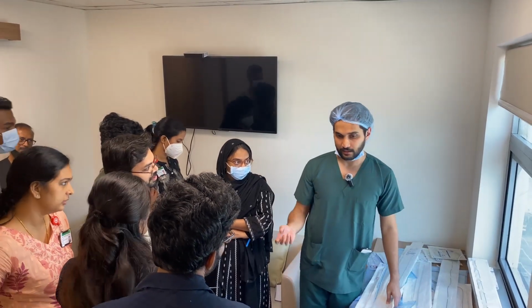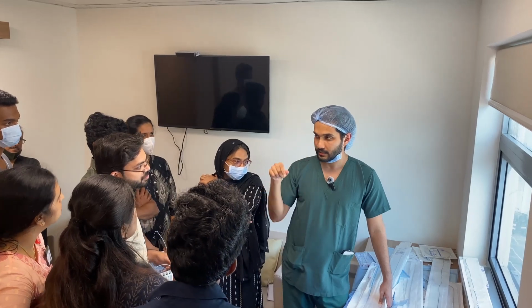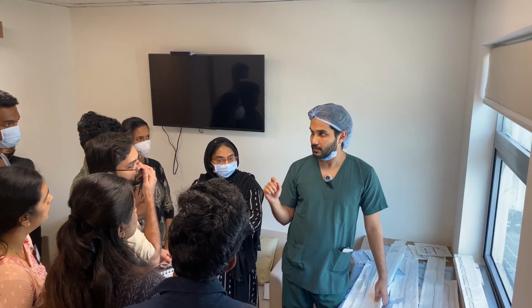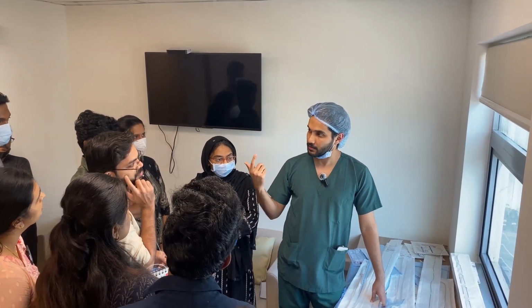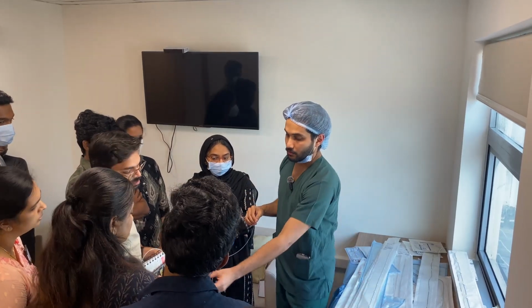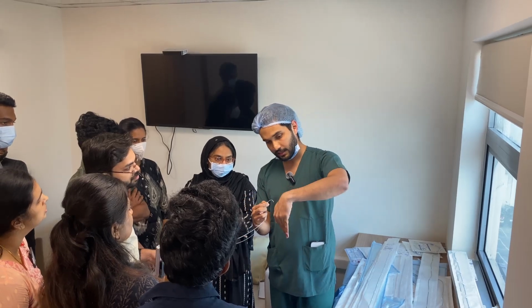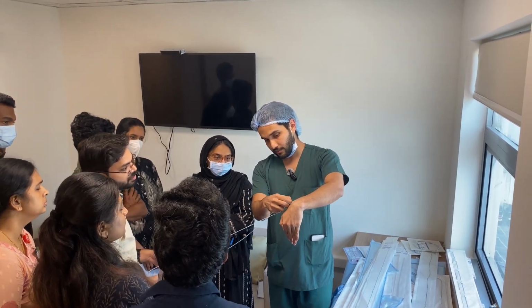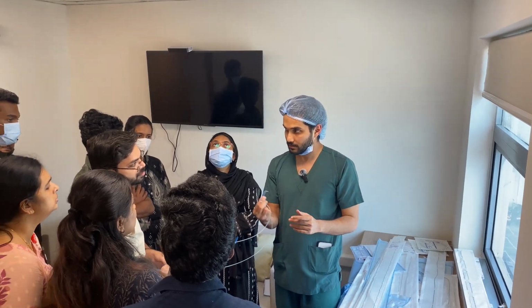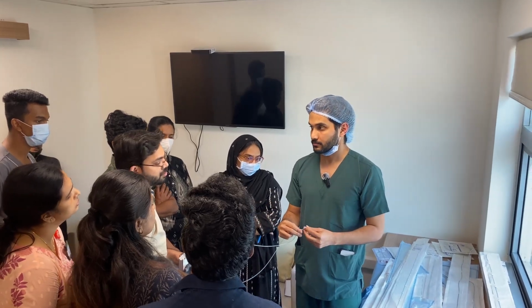ബ്രോങ്കിയൽ ആർട്ടറി നിങ്ങൾ തന്നെ ചിന്തിക്കുക, ഉപയോഗിക്കാൻ പറ്റുന്നത്. ബ്രോങ്കിയൽ ആർട്ടറി പൊതുവെ ഒറിജിനേറ്റ് ചെയ്യുക ഡിസെൻഡിങ് അയോർട്ടയുടെ ഇനിഷ്യൽ പാർട്ടിൽ, അല്ലെങ്കിൽ ആർച്ചിന്റെ താഴെ നിന്നാണ്, അറ്റ് ദ ലെവൽ ഓഫ് ഹൈലം. അപ്പോൾ അവിടെ നിന്ന് വരുന്ന സമയത്ത് നമ്മൾ അതിന്റെ ഒറിജിൻ അനുസരിച്ചിരിക്കും. എല്ലാ പ്രാവശ്യവും ബേൺസ്റ്റീൻ ഉപയോഗിക്കാൻ പറ്റില്ല. ഈ ഒരു ഷേപ്പ് വെച്ചിട്ട് നമുക്ക് ഹുക്ക് ചെയ്ത് പിടിക്കാൻ പറ്റില്ല. കോബ്ര ഉപയോഗിക്കാൻ പറ്റും, സിമ്മും ഉപയോഗിക്കാം. അയോർട്ടയുടെ താഴോട്ട് ഇങ്ങനെ വരുന്ന ഭാഗത്താണെങ്കിൽ ഒറിജിൻ ഇങ്ങനെയല്ല. അപ്പോൾ ഫ്ലോ അനുസരിച്ച് ഹുക്ക് ചെയ്ത് നിൽക്കുന്ന ഒരു സാധനം വേണം. പക്ഷെ എല്ലാ പ്രാവശ്യവും ഒരേ കത്തീറ്റർ തന്നെ വർക്ക് ചെയ്യണമെന്നില്ല. പല കത്തീറ്ററും മാറ്റി മാറ്റി എടുക്കേണ്ടി വരും.